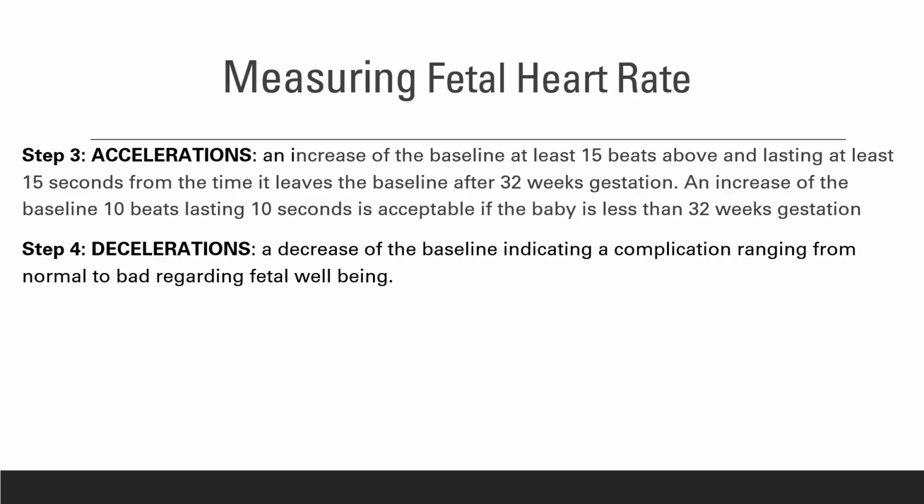And the last step is the deceleration. So once you've established your baseline, your variability, if there's acceleration, the last step is to determine if there's any deceleration. A deceleration is a decrease from the baseline, indicating a complication ranging from normal to bad regarding fetal well-being. So we will go deep into the deceleration segment in a little bit.